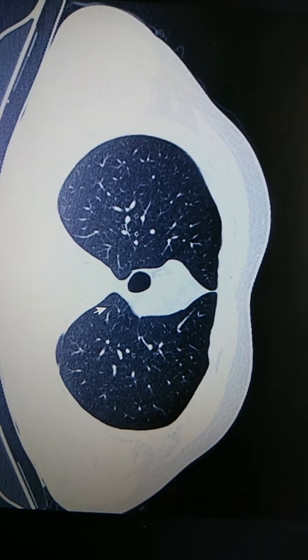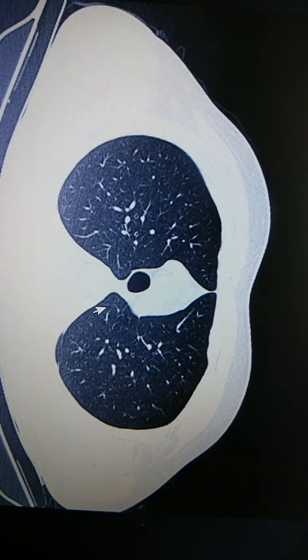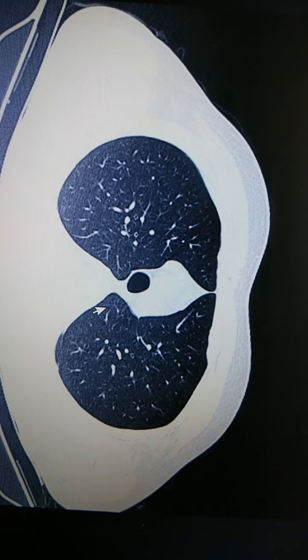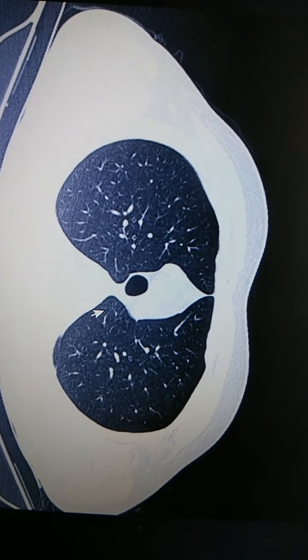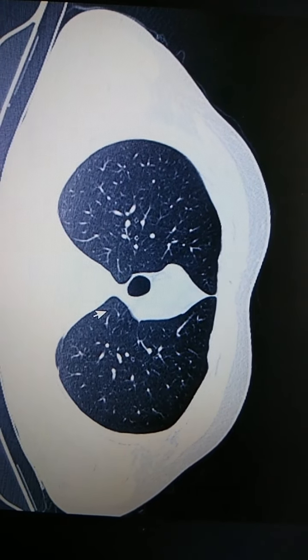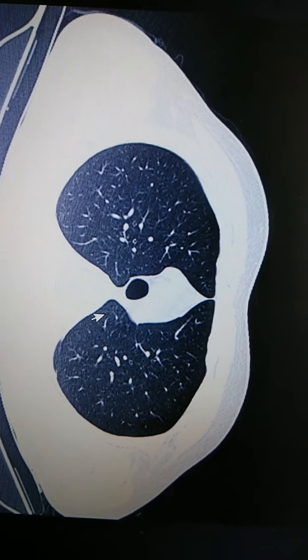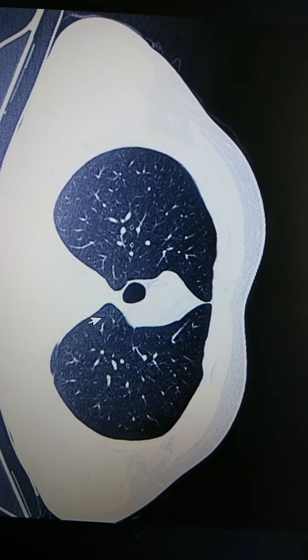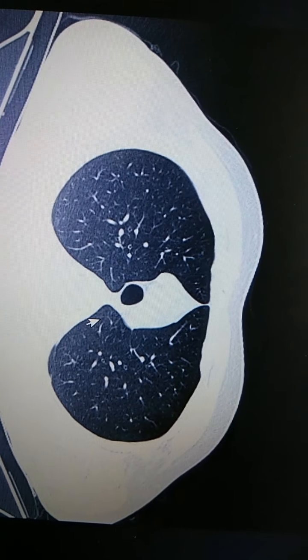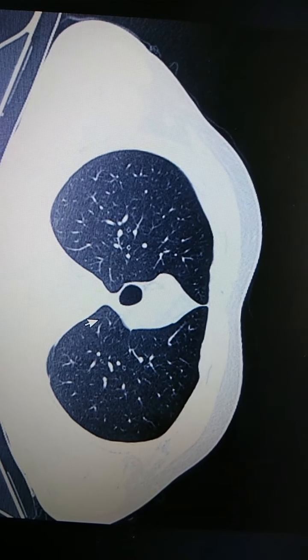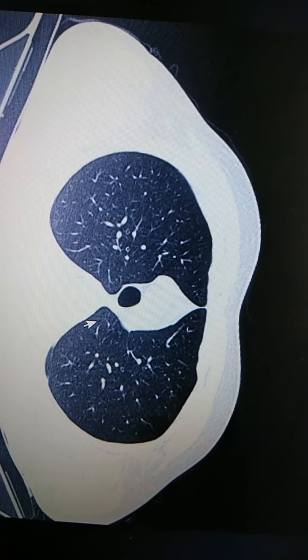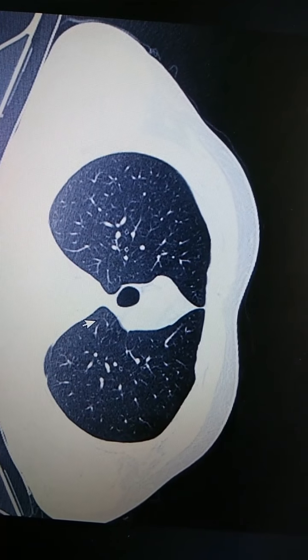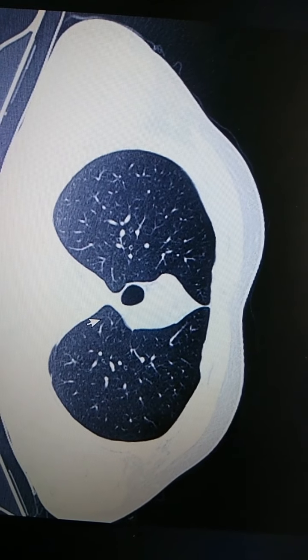Hello friends, today we are going to study regarding the lobar and segmental bronchi division on CT thorax. As you all know, the right lung has 3 lobes and the left has 2 lobes. The right side has 10 bronchopulmonary segments and the left side 8 bronchopulmonary segments. We are going to study regarding the lobar bronchi and segmental bronchi.